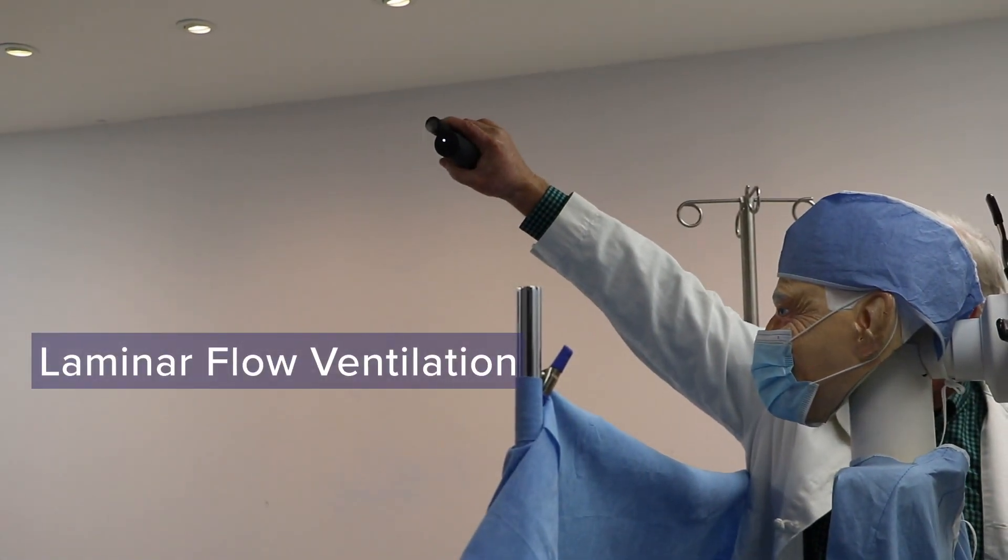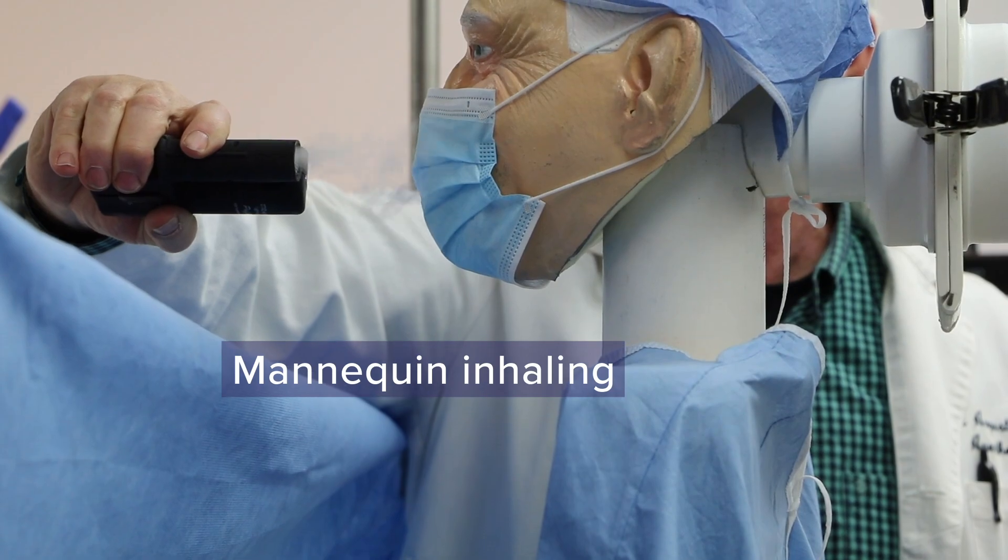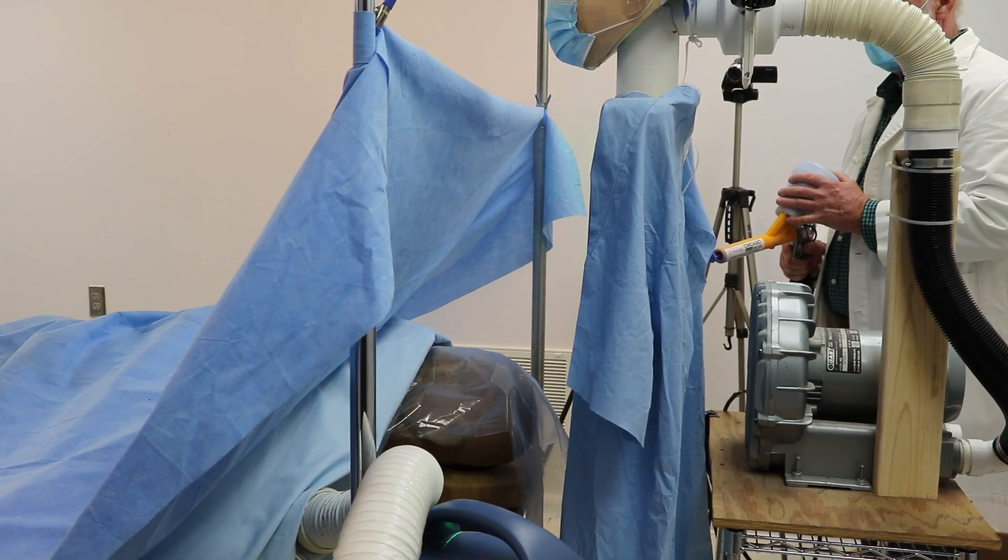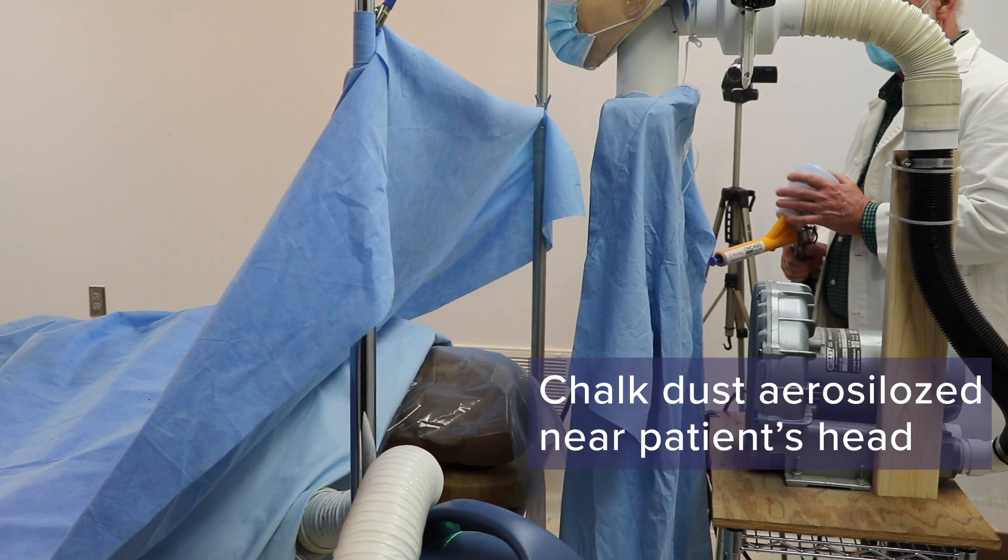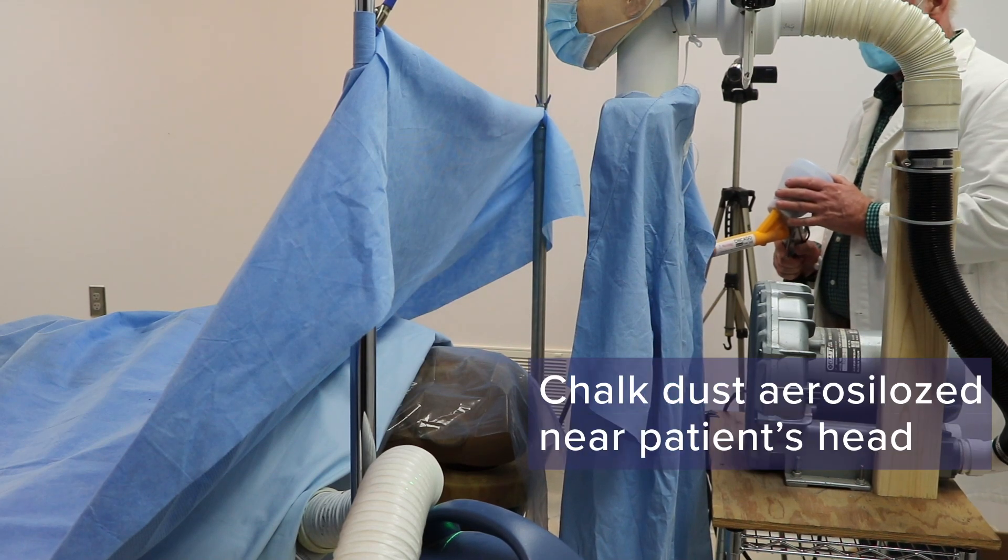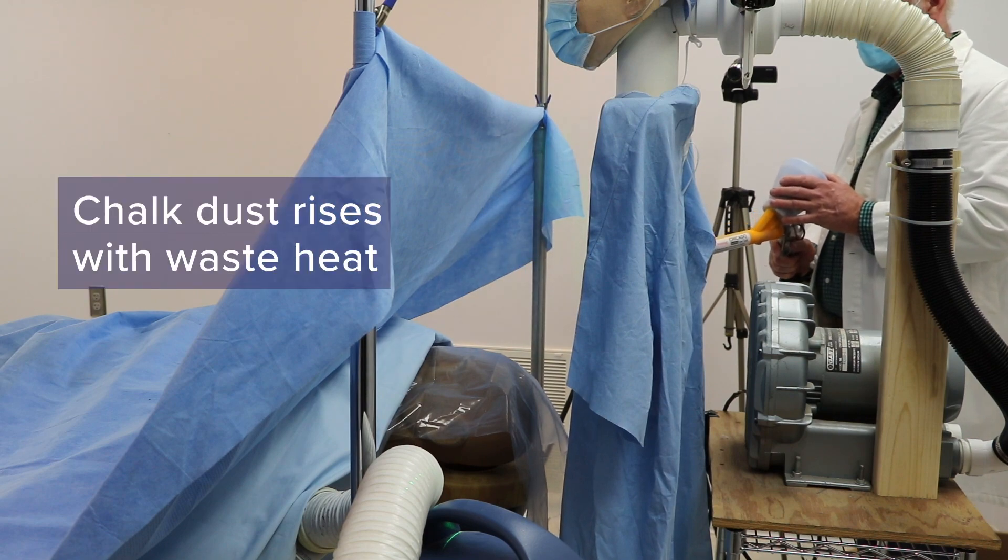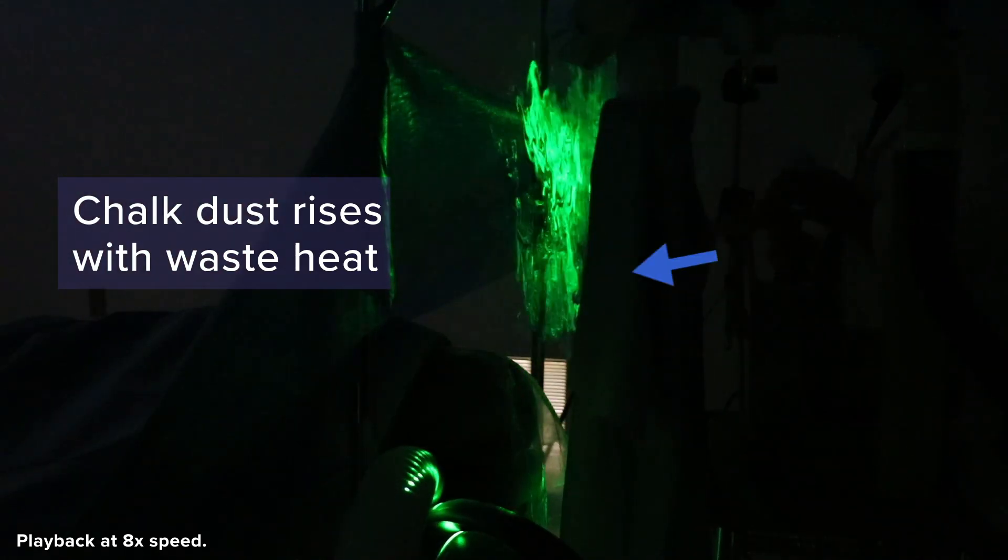The laminar flow system is effective. An inhalation simulator is operating. An upper body forced air blanket is warming on the high setting. Chalk dust is aerosolized near the patient's head under the anesthesia drape. It is sprayed ten times from a consistent angle, well below the anesthesia provider's breathing zone.